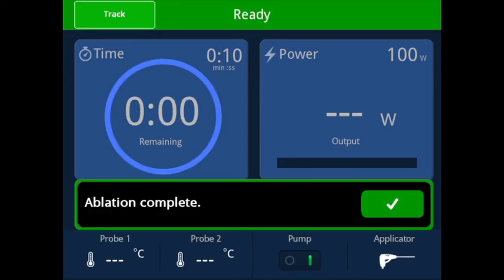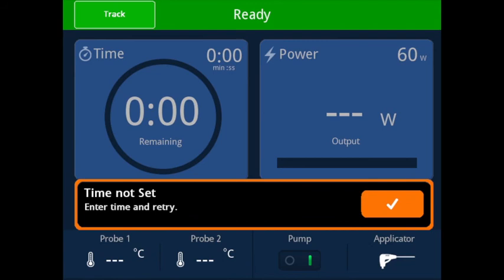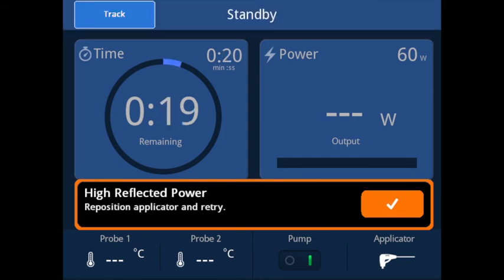The ablation complete prompt will indicate that the ablation has completed when the time remaining reaches zero. If the ablation procedure is interrupted through use of the microwave activation button or the foot switch, the system will display the ablation aborted prompt. If the end user attempts to initiate microwave power without the time set to a value greater than zero seconds, the system will display the time not set warning. If the reflected power exceeds the preset threshold, abort the ablation, as microwave energy is unable to be effectively transferred from the applicator tip into the targeted tissue due to desiccation. Please refer to the Solero Generator Operators Manual for troubleshooting.